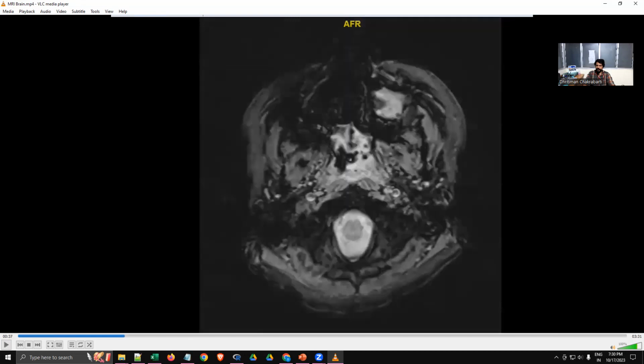Okay. Now I'll be showing you the SWI images. Remember, the susceptibility weighted imaging, SWI, has got mineralization deposits which appear black. So your arteries and veins containing deoxyhemoglobin, your microhemorrhages which contain deoxyhemoglobin, your substantia nigra, red nucleus inside the brainstem which contain ferritin and hemosiderin, and lastly your mineral deposits of calcium, which can appear inside the tumor, which can appear in sites of gliosis of old trauma to the brain, or which can appear normally in your choroid plexus and pineal gland. Okay, so they all will appear black, dark, deep black.